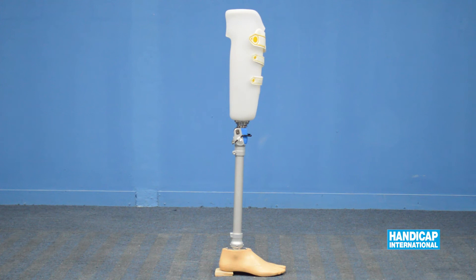In the sagittal view, the alignment line should pass one centimeter ahead of the posterior third of the foot. The knee should be about one centimeter behind the line of gravity, and at the socket it should pass 50% anterior and 50% posterior.